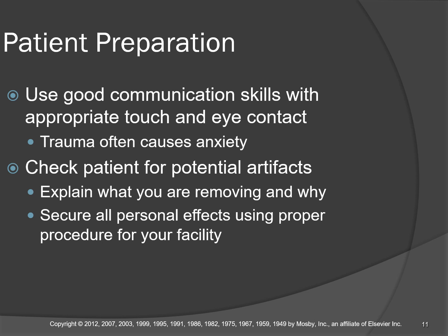Okay? Check for potential artifacts. People that get into car wrecks, a lot of times they're wearing jewelry. No one plans on getting in a car wreck. Oh, you know what? I think I've got a car wreck scheduled for 10 o'clock today. I'm late for that. No one schedules a car wreck. No one schedules trauma. And so your patient's going to show up with oodles and oodles of artifacts on. Okay? If you know you're going to the doctor, are you going to wear your jewelry? No, because you know the doctor is going to be a pain in the butt. The doctor's just going to make you take it off for the examination.